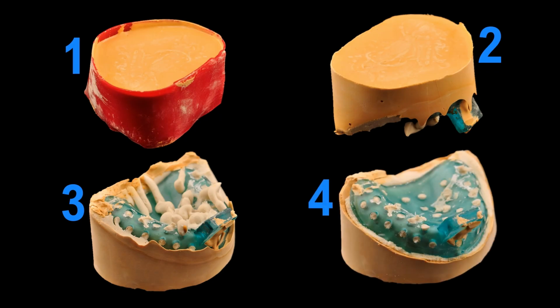So do it now. Once the stone has cooled completely, meaning it's cool to touch, trim the excess stone and alginate around and inside of the tray and clean that area as much as possible. You can use a Buffalo knife or a 25 blade to do this part. This will help you remove the tray much faster and cleaner.